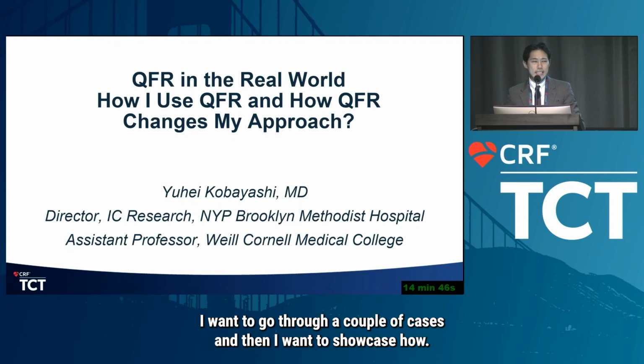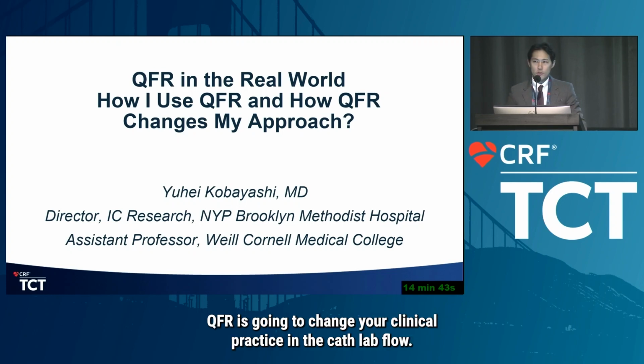I want to go through a couple of cases, and then I want to showcase how QFR is going to change your clinical practice in the cath lab flow.